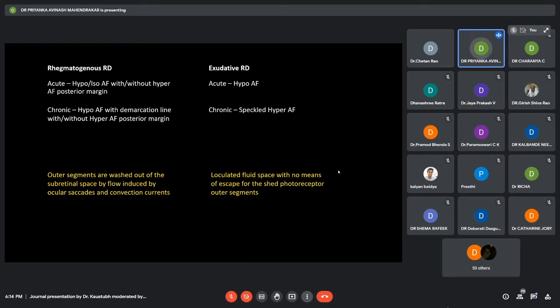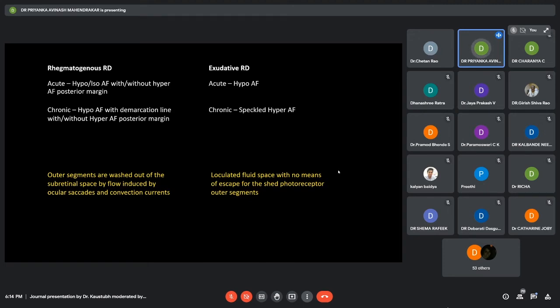Whereas in an exudative RD, the fluid is in a loculated space with no means of escape for the shed photoreceptor outer segments, causing increased metabolic activity of the RPE, causing hyper-autofluorescence.